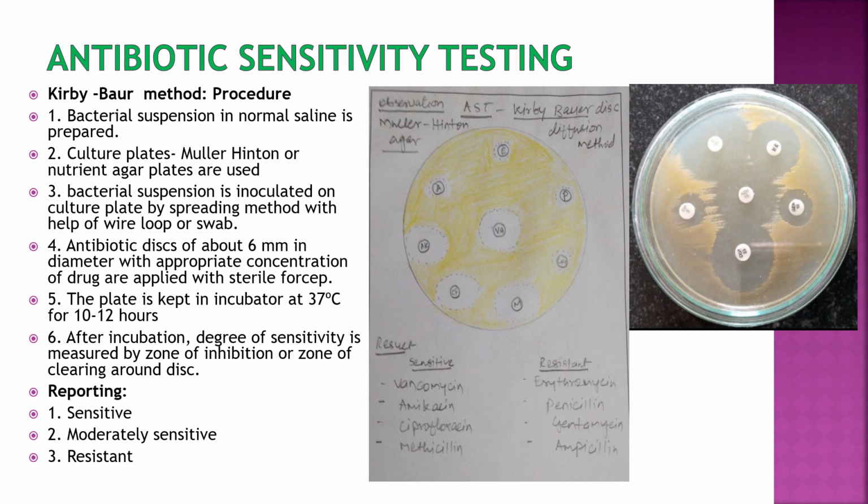Antibiotic sensitivity testing is done on Mueller-Hinton agar, and that is usually done by the Kirby-Bauer disk diffusion method.